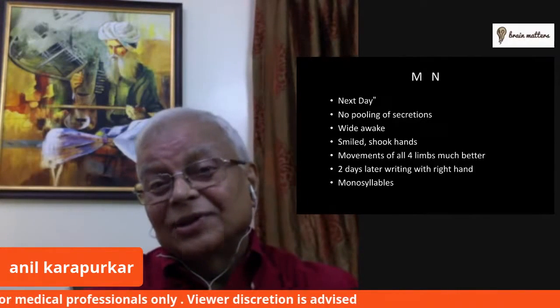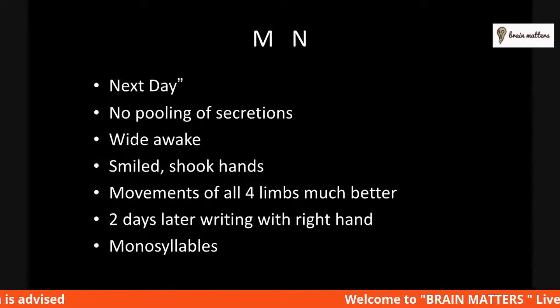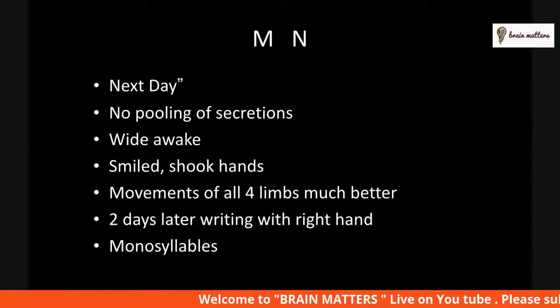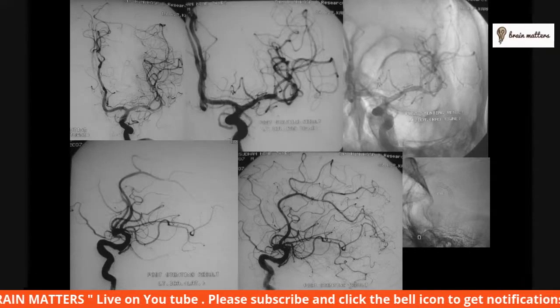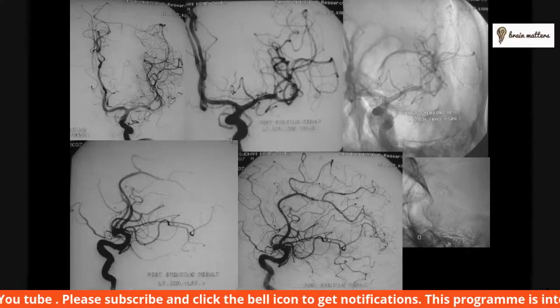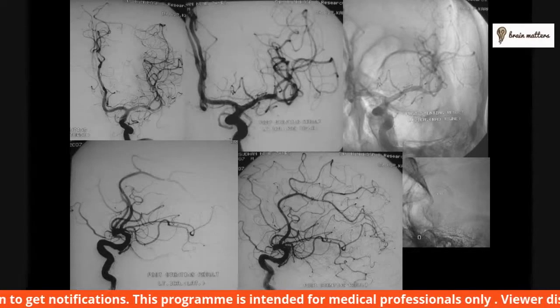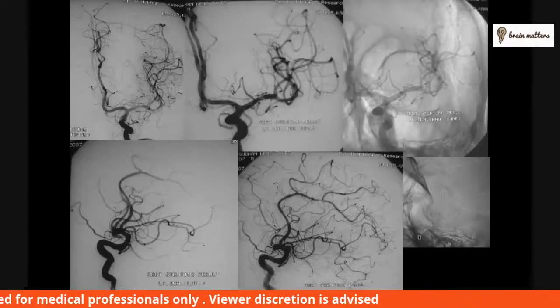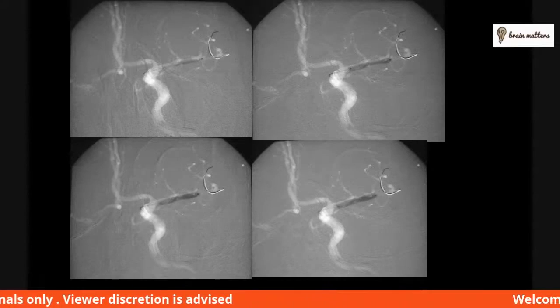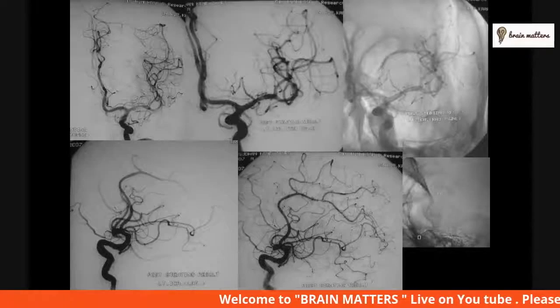And then in 2007, we stented his left M1 with, again, a drug-coated coronary balloon-mounted stent. And this was a Zions stent. I don't remember the diameter or the length of the stent which we used at that time, but it was a Zions, as you can see here. This is a balloon-mounted drug-coated stent.